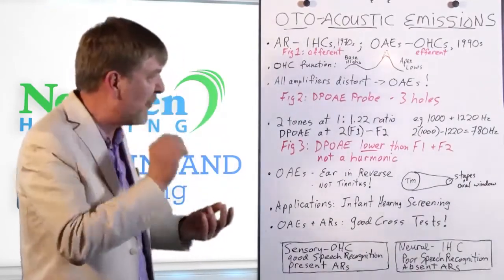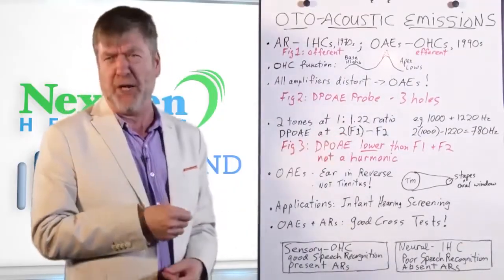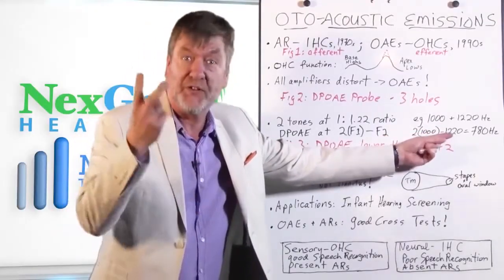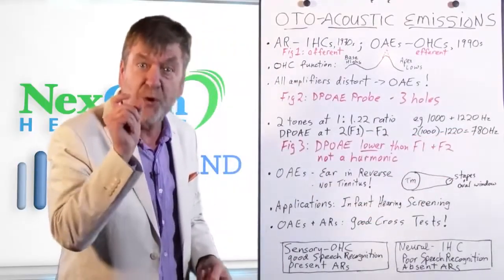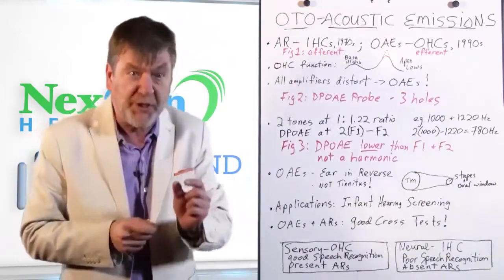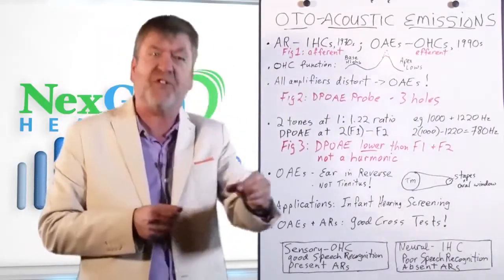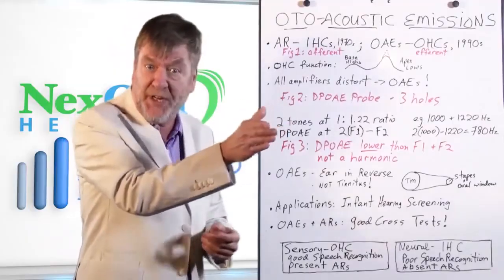That's the otoacoustic emission. And in humans, the strongest otoacoustic emission happens to be at 2F1 minus F2. Well, in English, again, that means 2 times 1,000 hertz, the frequency of the first tone, which is going to be 2,000, minus the frequency of the second tone. And it's at that particular frequency then that the otoacoustic emission will be if the 2 tones are 1,220 and 1,000 hertz. What we do in audiology is we emit pairs of tones surrounding 250 hertz, pairs of tones around 500 hertz, pairs at around 1,000, pairs at 2, pairs at 4. And in that way, we test the otoacoustic emissions resulting across the frequency range of human hearing.